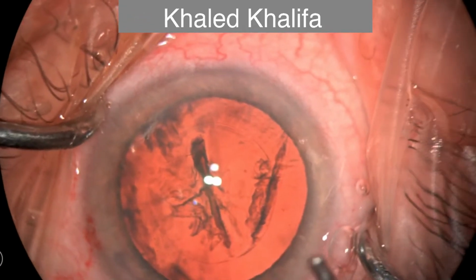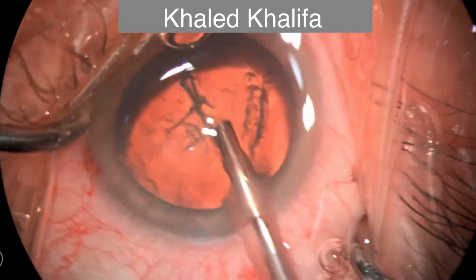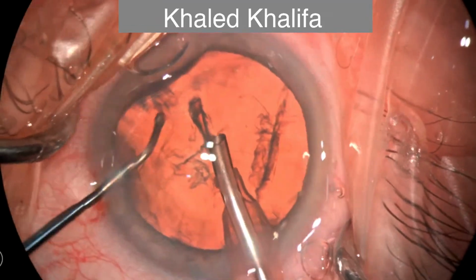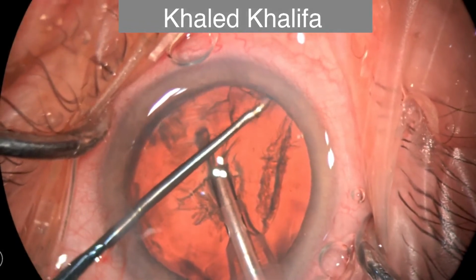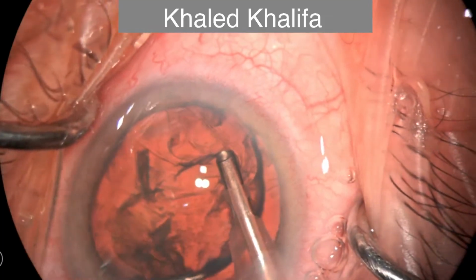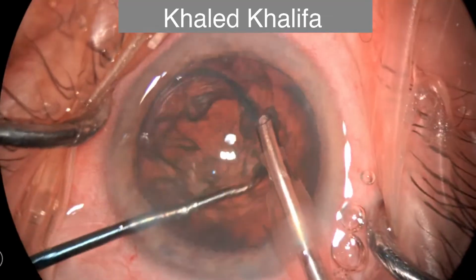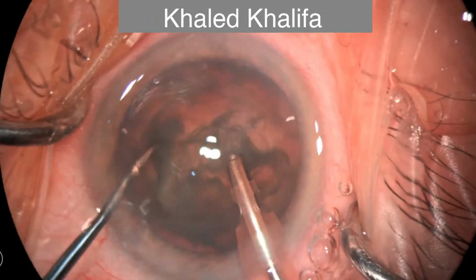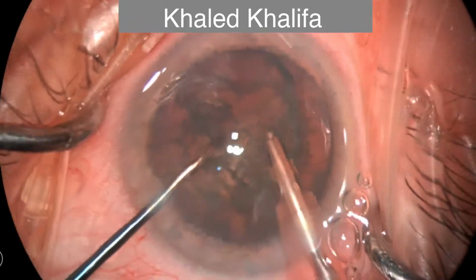Usually I don't change my technique in different grades of cataract. Here I went into the anterior chamber. This is my chopper going under the anterior capsule. I know that this case is a shallow anterior chamber, so it's very essential to have plenty of chops of the nucleus as possible as I can.